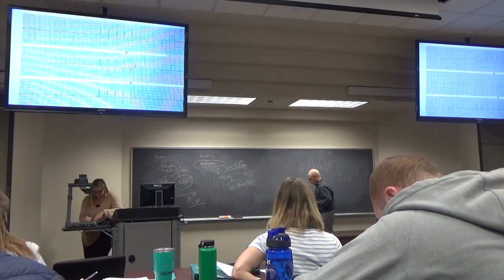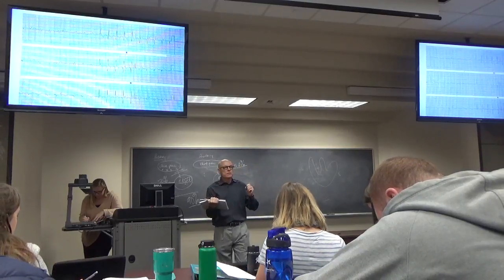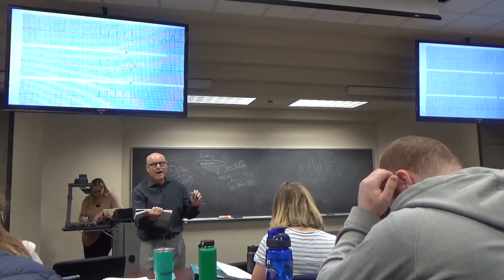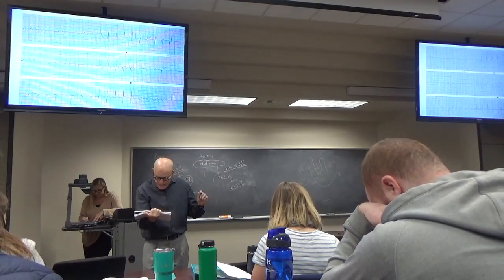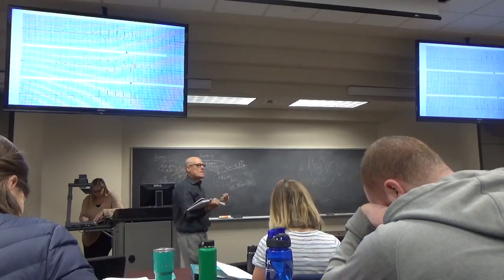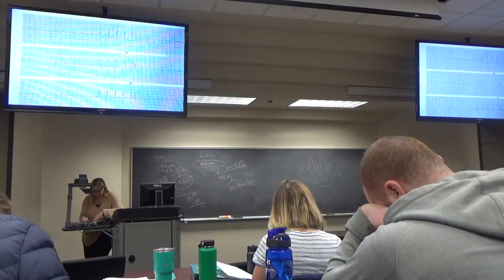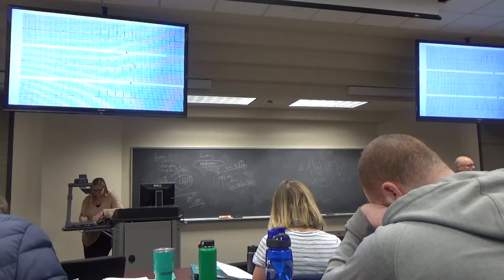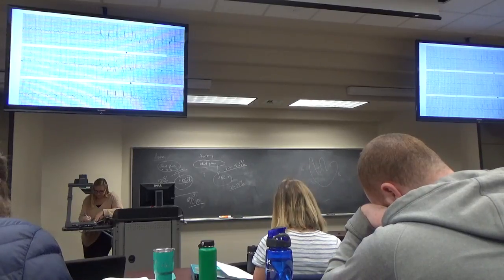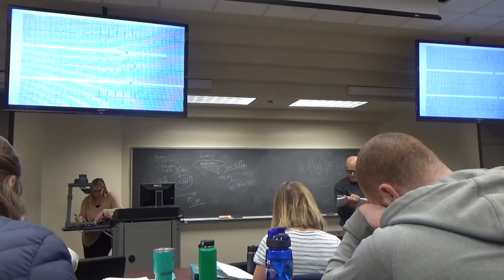Okay. So you had an infarction? Yeah. And it was anterolateral? Anteroseptolateral. Yeah. And then the age indeterminate. And it's age indeterminate or acute, either one of those would work. Everyone agree with that? Sinus tachycardia. I went back and forth. I was asking if you agreed with the infarct. I thought V5 was injury.